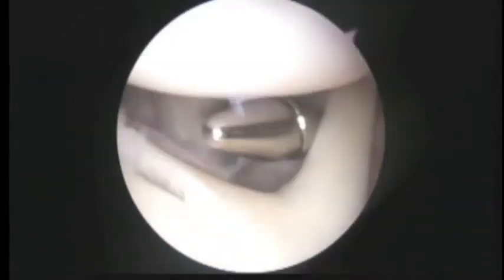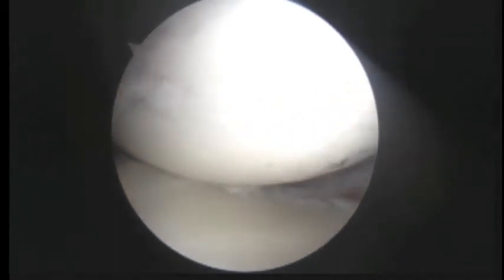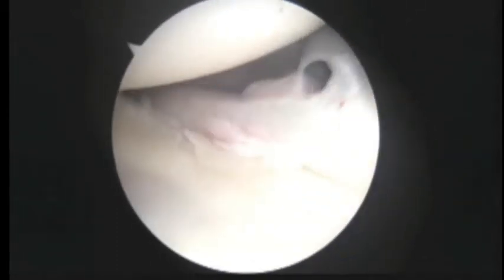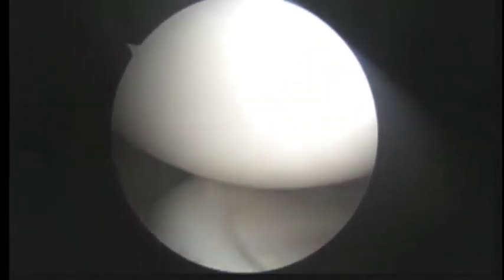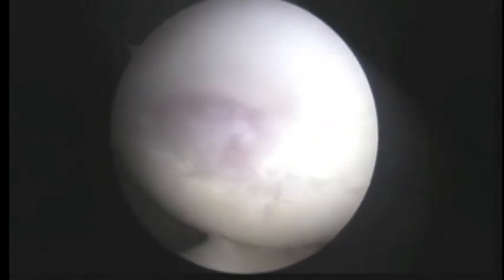As we look down the front, we've already confirmed some of the injuries that we suspected with the damage to the front of the shoulder. We'll see that a little bit better in a minute. The humeral head isn't that damaged, which is good. You can see a little bit of scuffing or cartilage erosion in the back half of the humeral head, but that's not too bad.